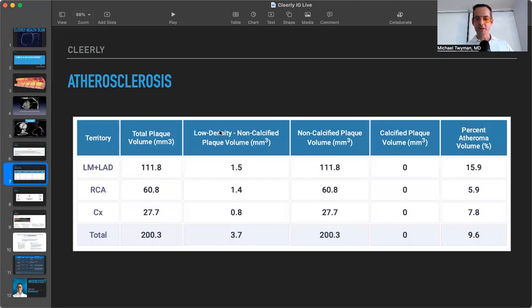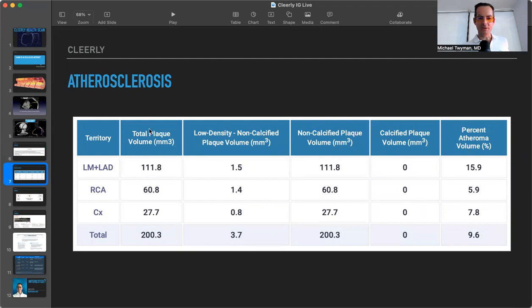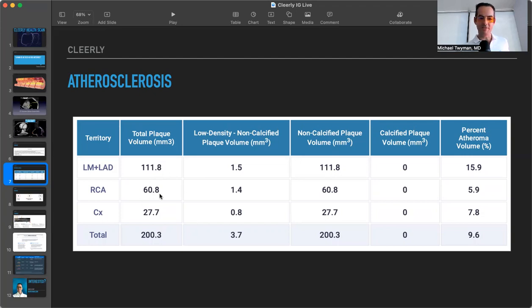So the other nice thing about this is it gives you a kind of like Excel sheet, where exactly is all the plaque. So the total plaque volume, 111.8 of it's in the left main and the left anterior descending, 60.8 of it's in the right coronary artery, and 27.7 is in the circumflex, giving a grand total of 200.3.